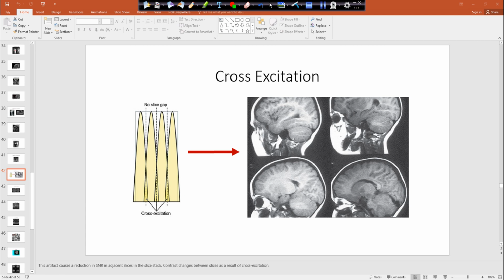So sometimes you need to reopen it. Like all those options they give you, you don't like any of those options, even if you hit first level. So the best solution to minimize the SAR is to go one concatenation up, because remember it's acquiring, and then it takes a little break, and then it goes back in. So it reduces the SAR by having that little break. So then you bump up your concatenations, and then you can adjust your TR appropriately. Okay.